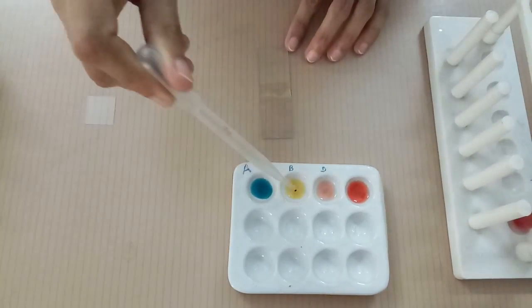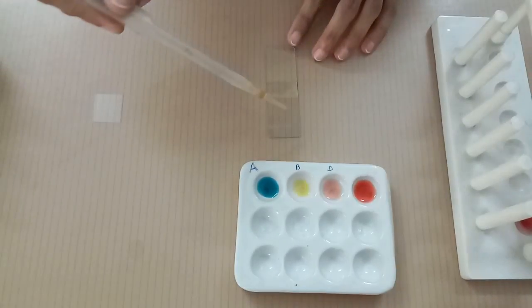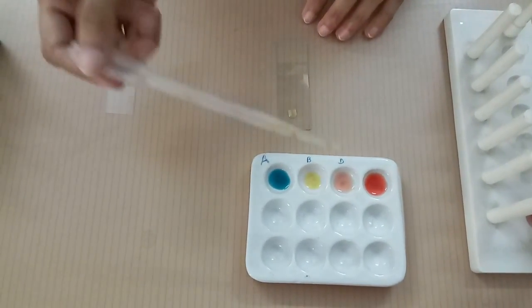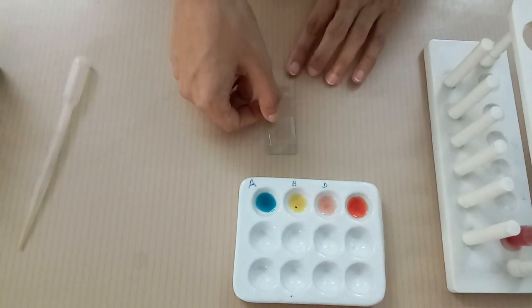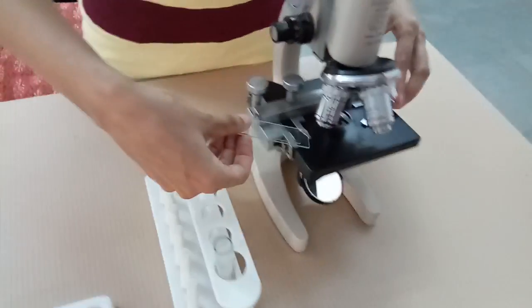Place a drop of agglutinated sample on slide. Place cover slip and confirm your finding under low power in microscope.